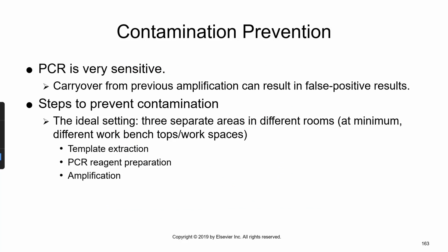Contamination prevention, so PCR is extremely sensitive. It'll amplify anything that has that sequence. So if you have contaminating DNA, then it might amplify something from the environment instead of amplifying something that was actually in the patient specimen. So there's specific work areas or workstations that you work in. Some labs require you to shower before you even come near the PCR station. There's special lab coats you have to wear. Hair has to be tied back. So there's all different precautions that are taken when preparing specimens for PCR.